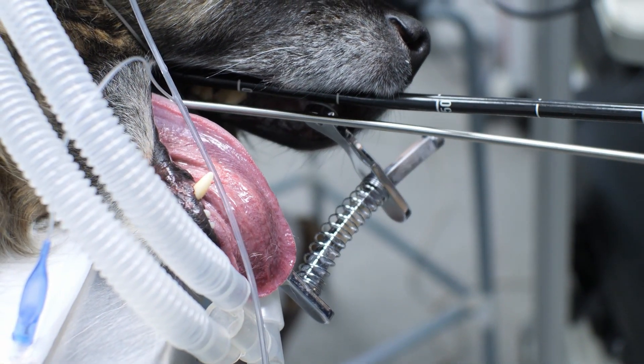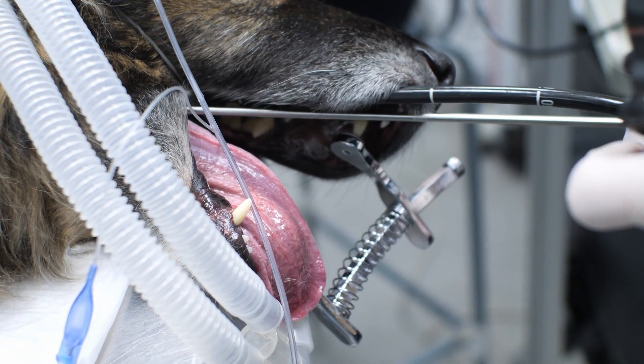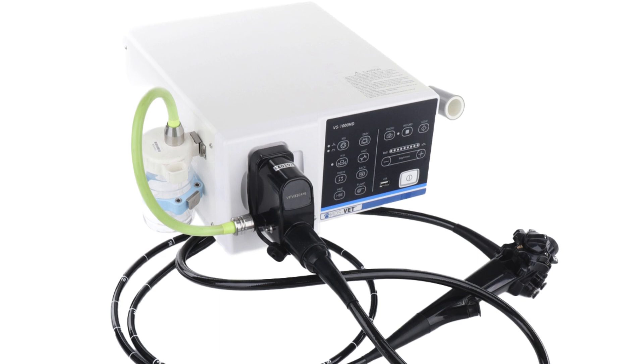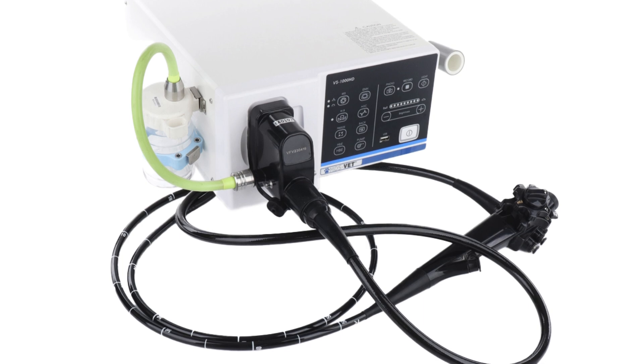Welcome to our Comprehensive Guide on the Setup and Operation of the MDS Vet Endoscope. This guide aims to provide the operator with an overview of this advanced technology, enabling its effective and efficient use.